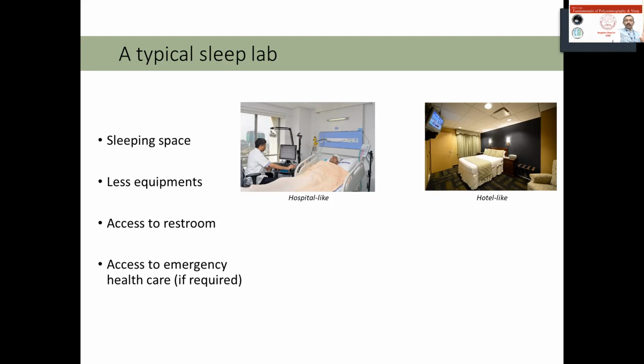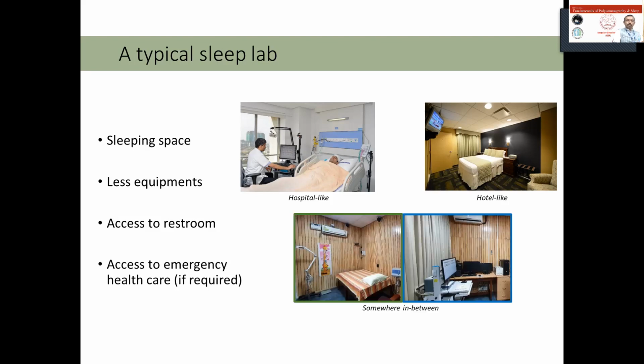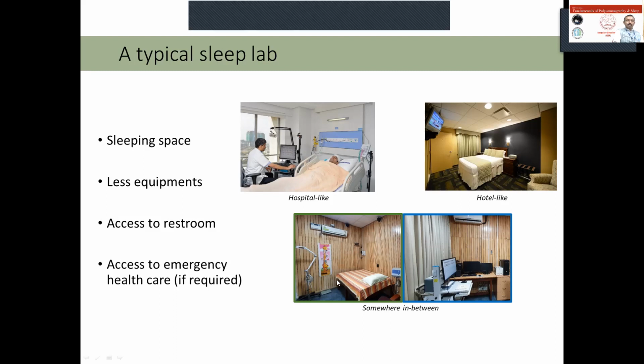A hotel-like environment is an ideal setup, but it's very costly. And many times we have to resort to something in between so that the equipment is minimized and the environment looks calmer. Other than the amplifier, most of the equipment, like the PC and the power unit, can ideally be shifted outside the room so that the subject can be monitored without interfering with the sleep of the person.